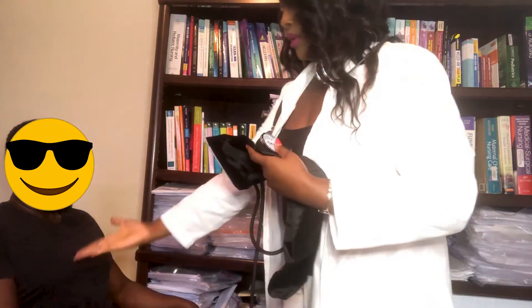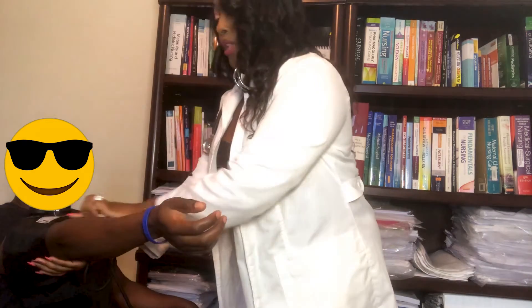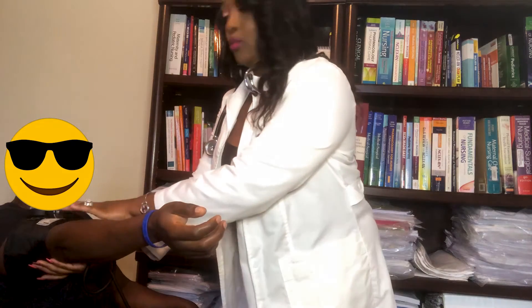So since I'm using the patient's right arm, I'm going to ask them to extend their arm. I'll put the blood pressure cuff over the arm making sure the arrow for the right arm is right over that artery. The cuff is placed right above the antecubital space — that's important.